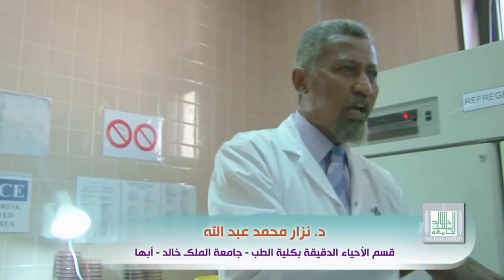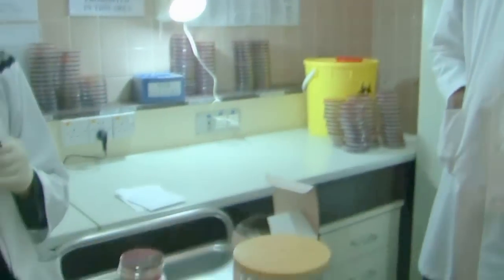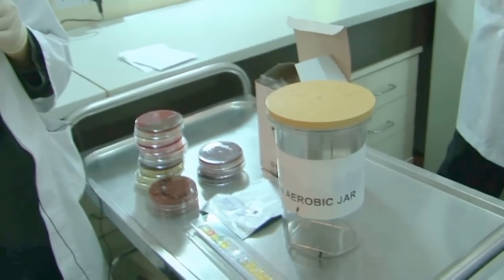These are gram negative. Actually, if you know your patient's clinical situation, like an abscess, for example, any abscess can be gram negative, anaerobic, it can be. Okay? So you need to use these plates. Any idea how many persons you test?